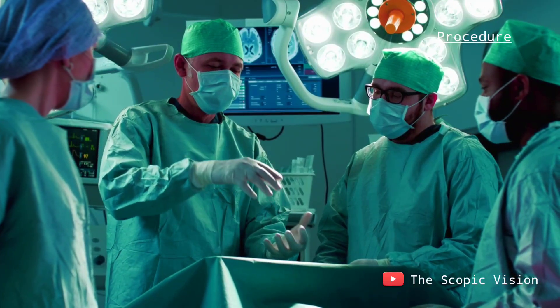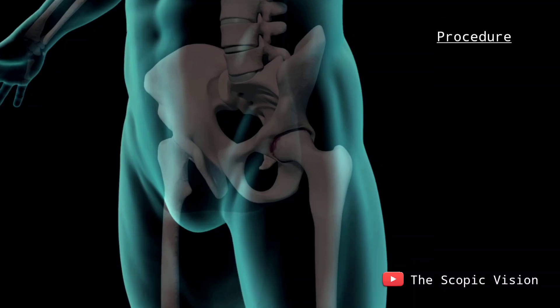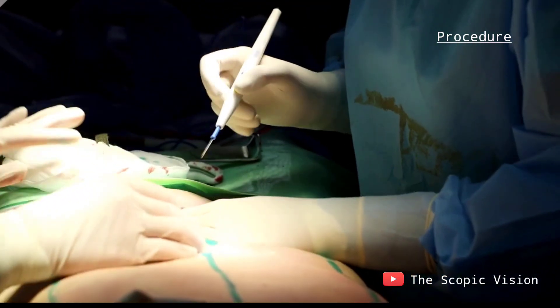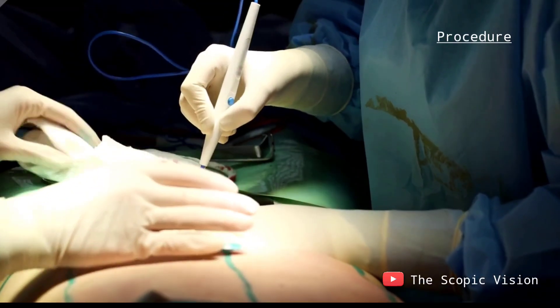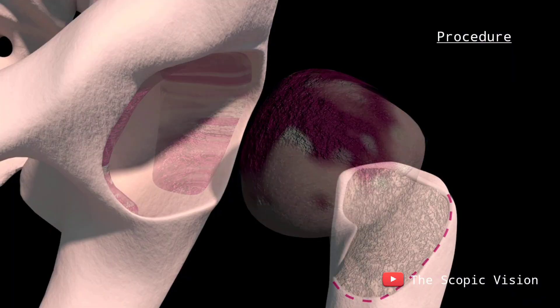During the procedure, the surgeon begins by making an incision in the hip area to access the joint. They carefully separate the surrounding muscles and tendons before detaching the femoral head from the acetabulum. The surgeon then removes any diseased bone and cartilage from the acetabulum.